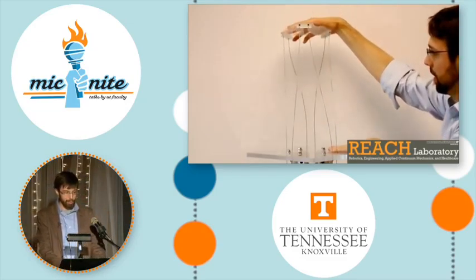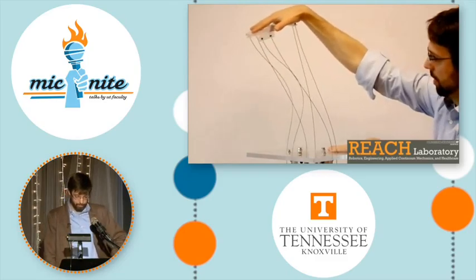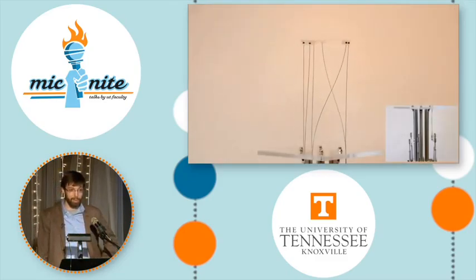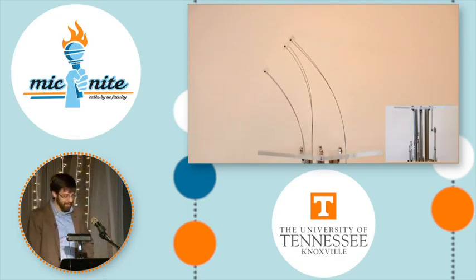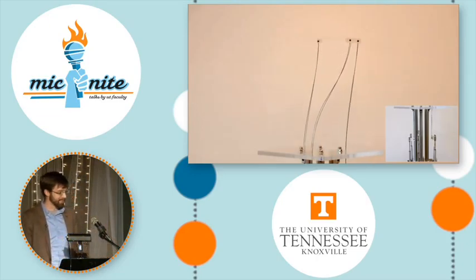Here's a demonstration of our first large-scale prototype. As you can see, it's very flexible. It has a good range of motion in all six degrees of freedom, including twisting, bending, and translating.